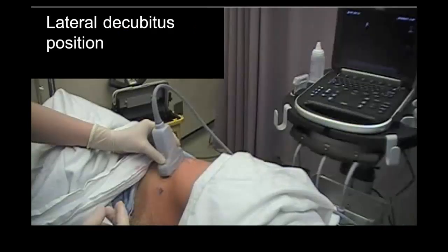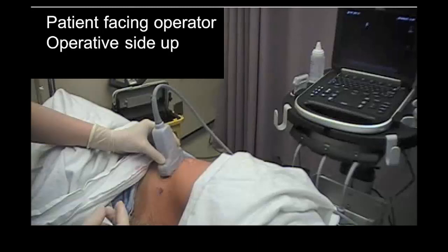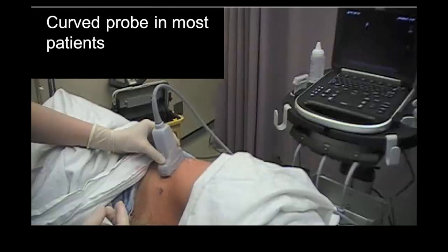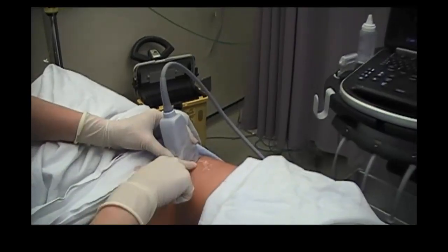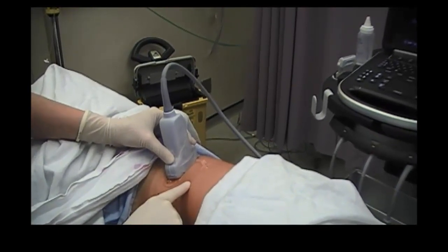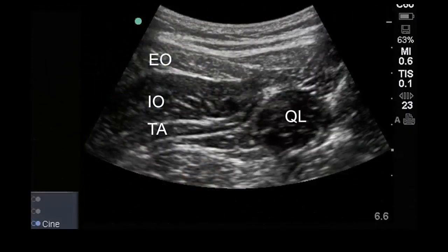It is recommended that the patient be placed in the lateral decubitus position, though it is also possible to perform the block with the patient supine. The patient is turned towards the operator with the operative side uppermost, and the machine is placed on the opposite side of the bed. The probe is placed in the mid-axillary line just above the iliac crest, and external oblique, internal oblique, and transversus abdominis are identified and traced posteriorly to where transversus abdominis tapers off into its aponeurosis.